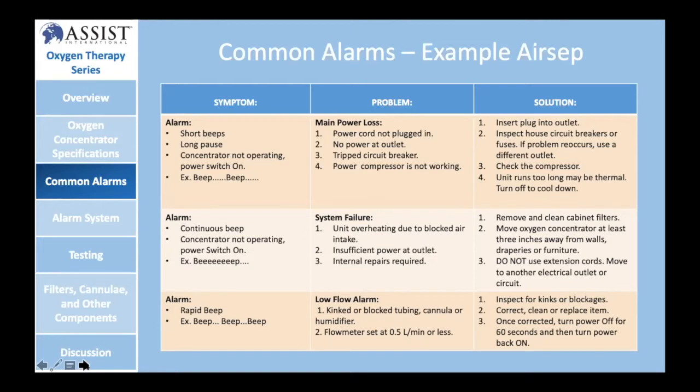We've seen a lot of burning of medical devices, their power cords catch on fire, including devices like infant warmers and incubators that are especially critical in terms of keeping newborns alive. And so we would recommend not using extension cords, as this can cause a lot of power related issues, and you'll probably hear a long, annoying beep sound from your oxygen concentrator if this is not taken care of. These are all very simple first responder things that you can take care of and make sure that your healthcare facility is utilizing oxygen concentrators in a safe manner.